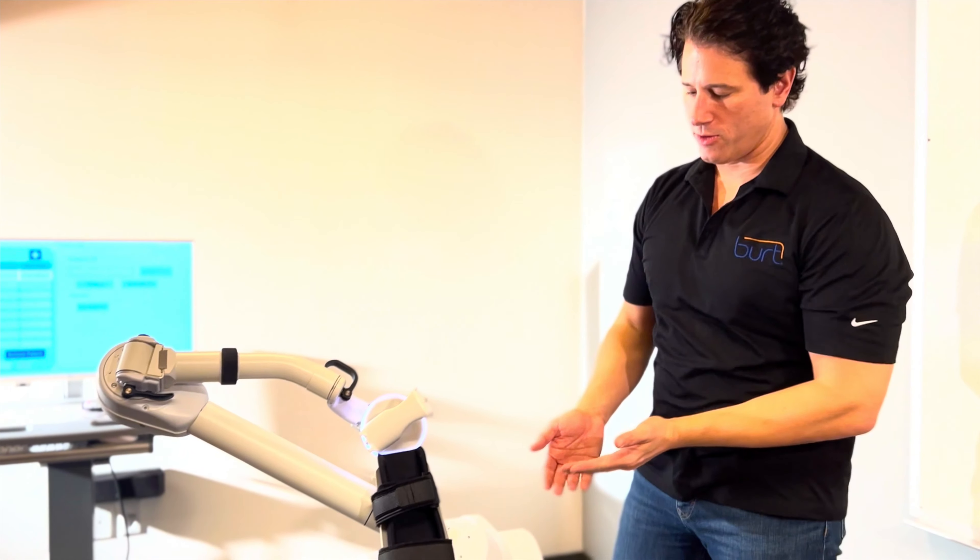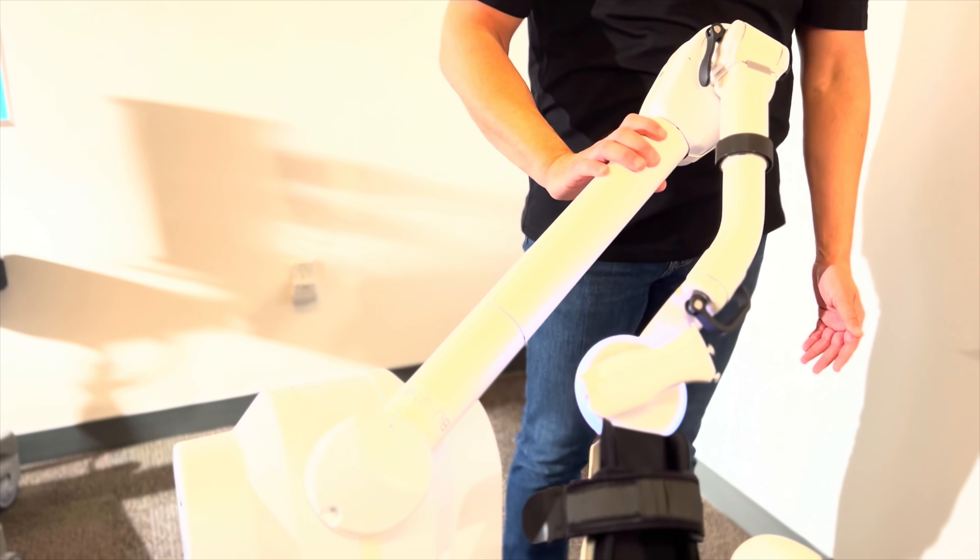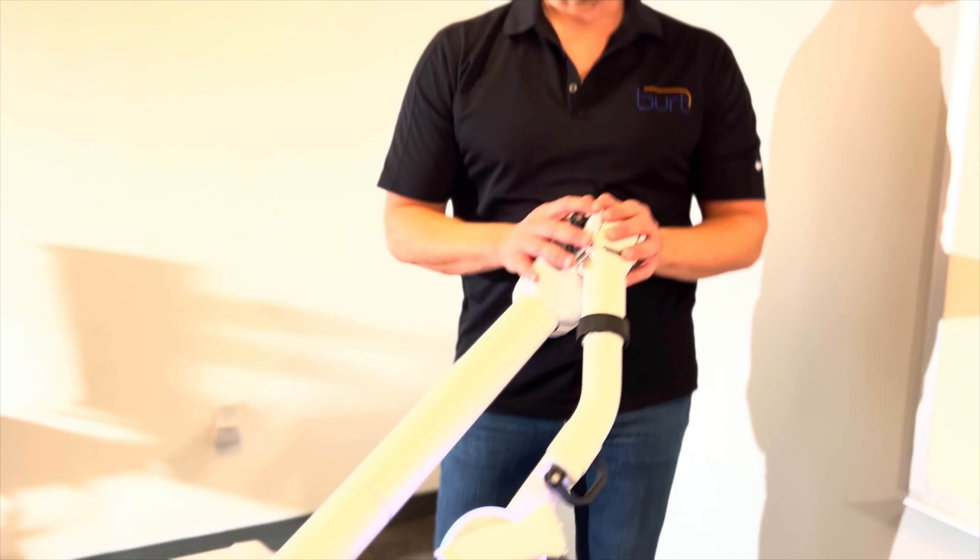The first step we do is we start at the shoulder, which is simple. We just slide it over. The next step, and this is the crucial step, is we go to the elbow.